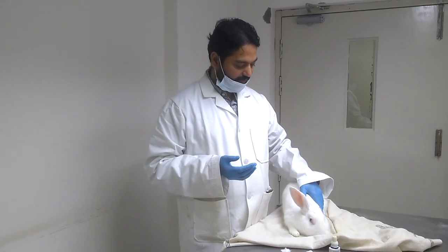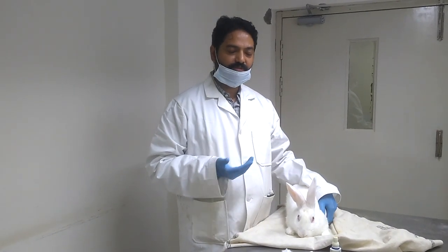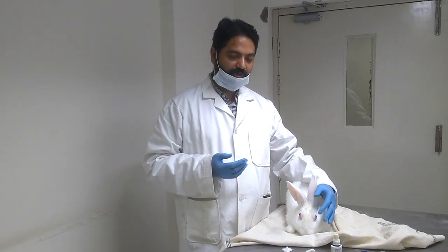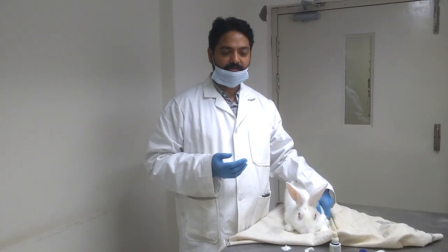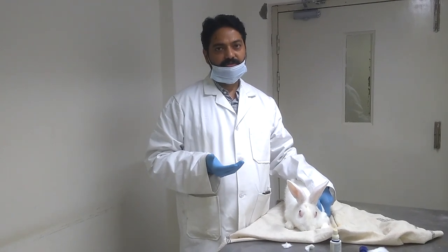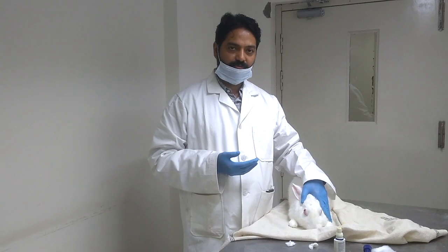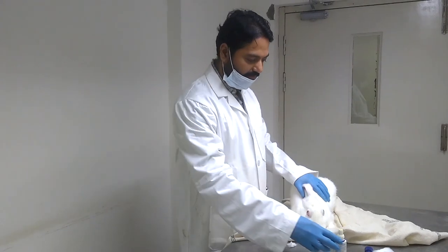Now you can see the whole of the animal, and this animal is very relaxed. I think it has very little or negligible pain. This is very important when you handle animals: whatever procedure you go through, the animal should be ensured not to have pain. If the procedure is painful, you anesthetize it. Since this procedure is not painful, we have not taken any such step. It is a very important step to ensure that the animal is relaxed.